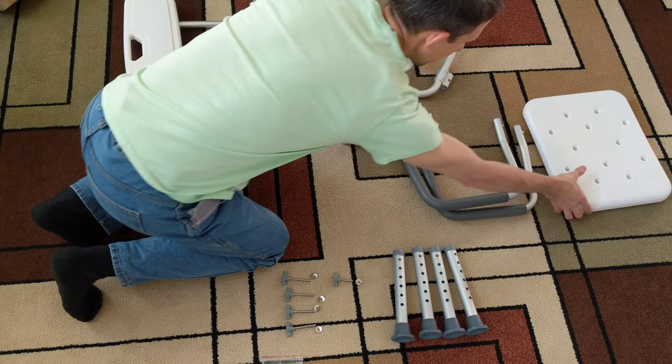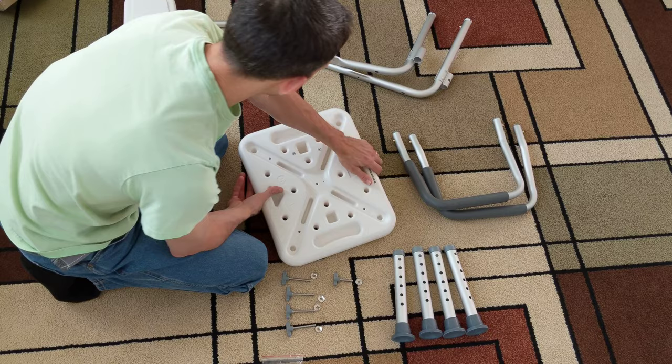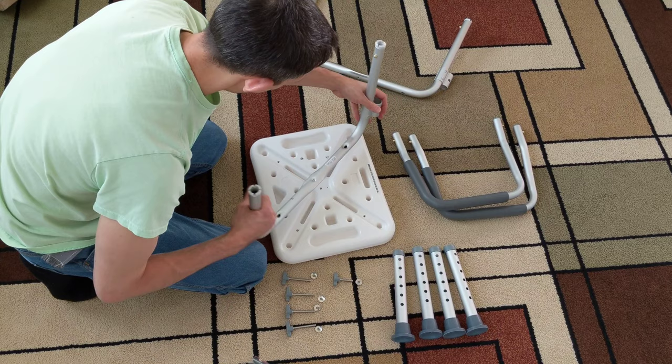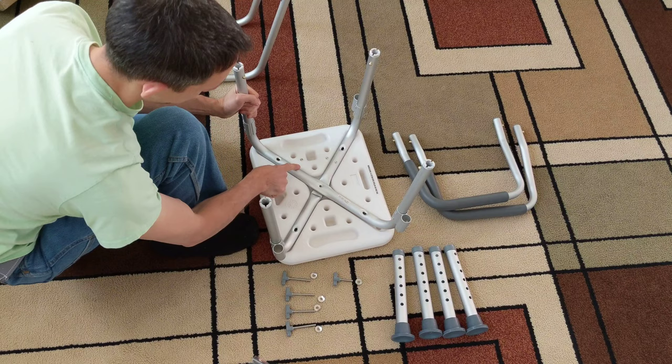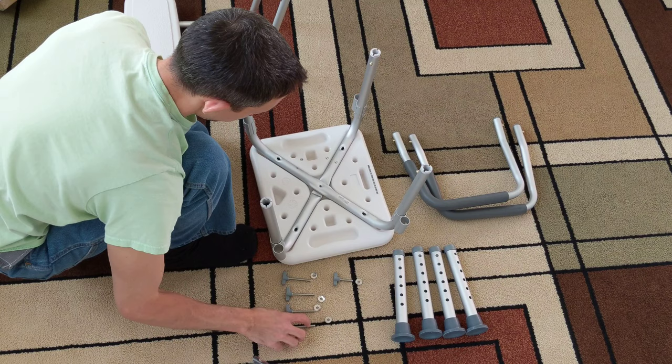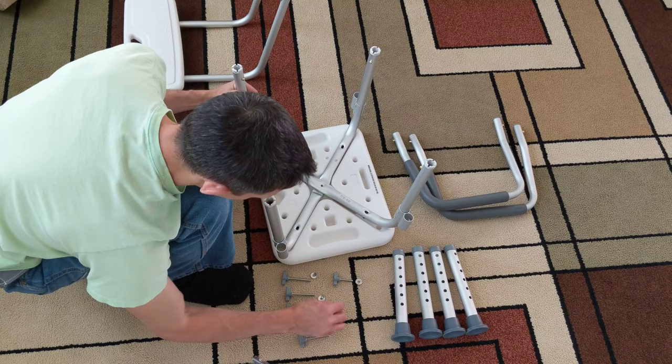Now it says we have a chair here. Warning: assemble the leg sections before installing backwards. So — one, two — looks like it goes this way, I'm guessing. We've got two here, seven there. These appear to be used with a short screw in the middle right there.